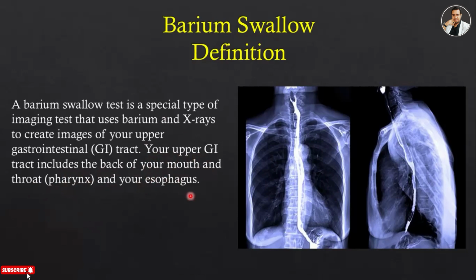So that's the definition. Barium swallow is a contrast X-ray of the esophagus. You have to visualize the esophagus from mouth to gastroesophageal junction.